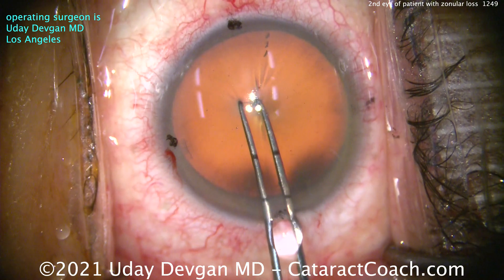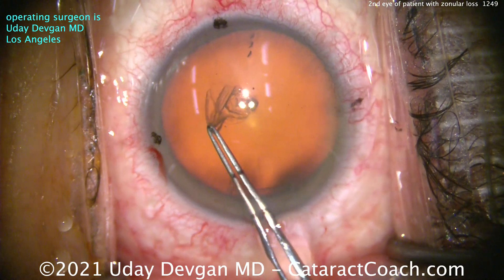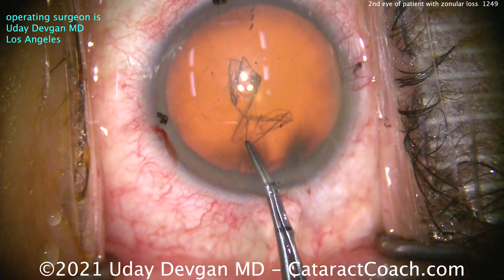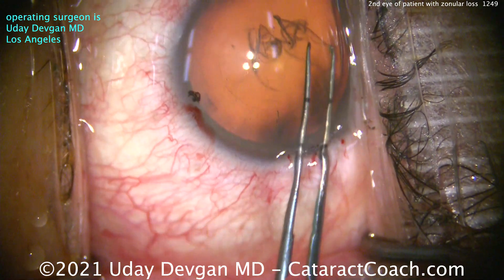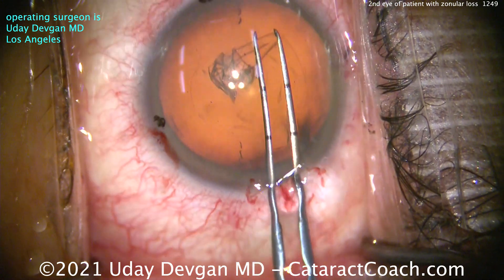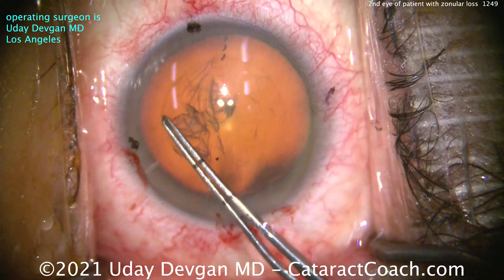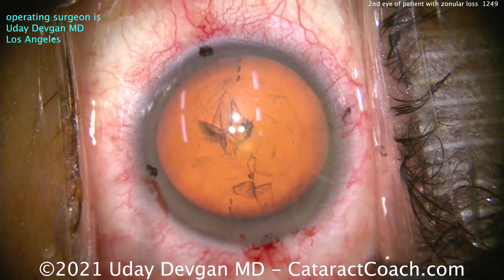What's going to happen when I touch the lens capsule? A little wrinkling, but not too bad — pretty good. The whole nucleus is not moving, so that's a good sign. Remember on the first eye there was a lot of zonular loss. Usually that can be two things: one, patient trauma — car accident, airbag hit the face, both eyes got hit very hard. Second could be some developmental thing — patient protoplasm, just how the tissue is. Often the first eye can help predict the second.